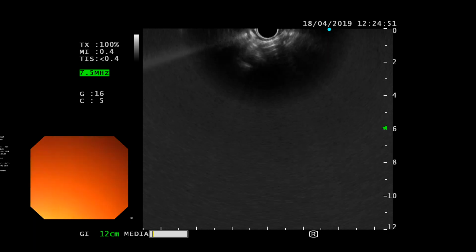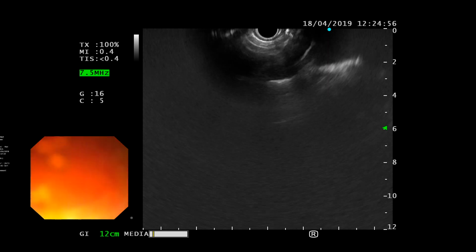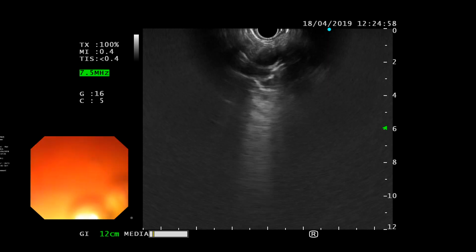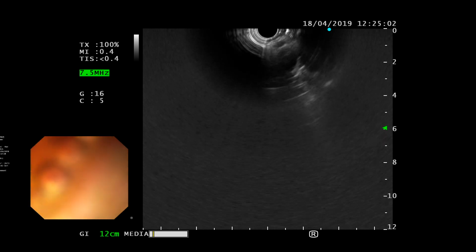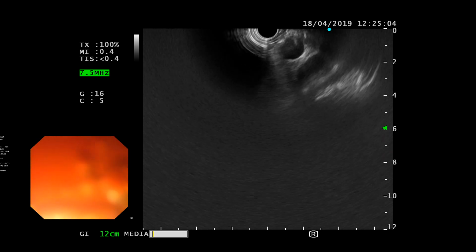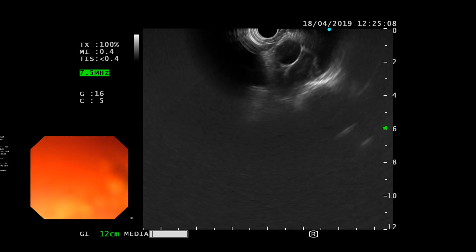Let's find the arch again. Just go a bit. Yeah, too far, so come back. I was just going back. Oh yeah, no, that's good. See, this is the right pulmonary artery just above. Yes. So go ahead and find the aorta.